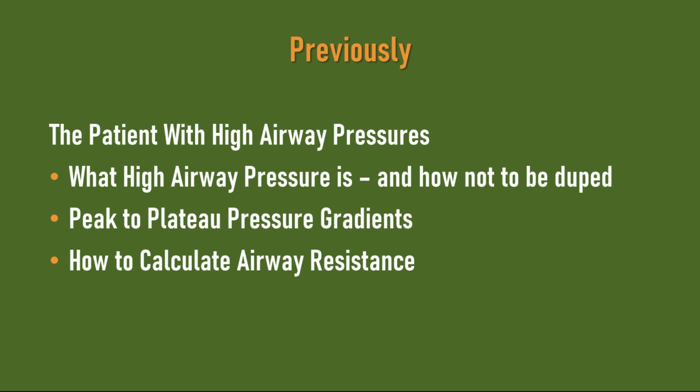does not exist. I continued the tutorial with a discussion of airway resistance, how to estimate and measure airway resistance using inspiratory pauses, and how to calculate inspiratory resistance. It is important to note that when you look at resistance on the ventilator, whether it is dynamic or static or you calculate it, you are looking at inspiratory resistance. Often the problem is in expiration.